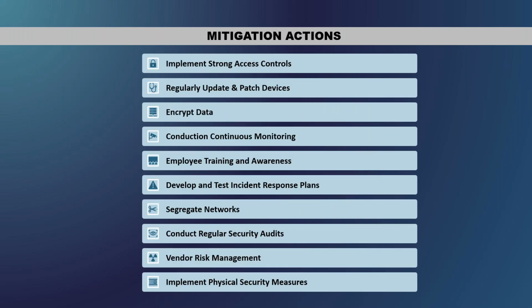And then, one more, information loss. Compromises of any medical device, particularly through loss or theft, can lead to significant breaches of sensitive data or cost to the organizations if they're losing a lot of data. And then you have the mitigation actions.